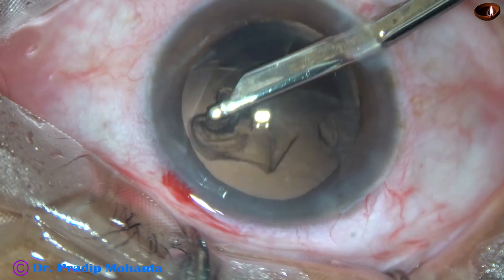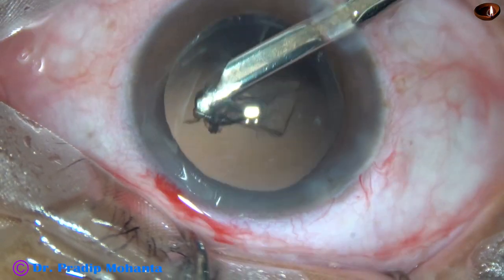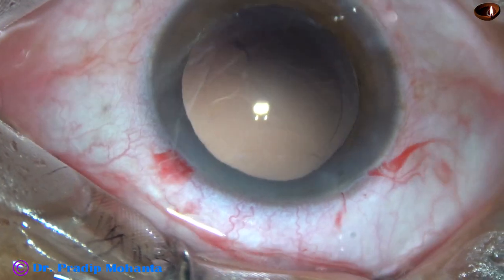And now, through the right side port, the sub-incisional cortex is removed.